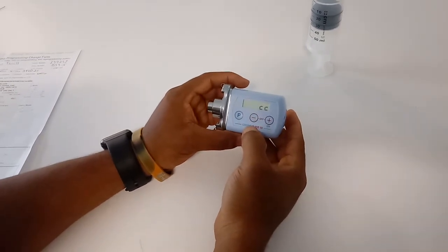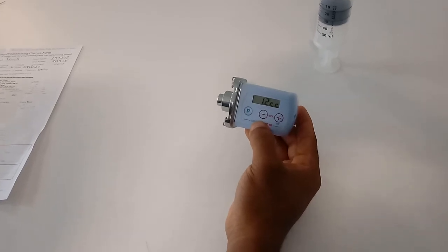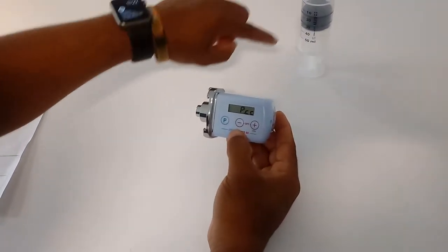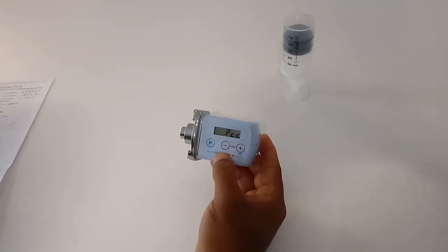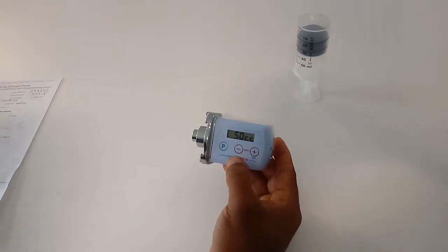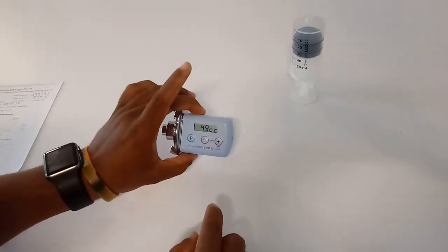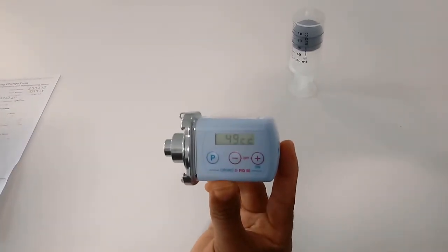I wait. It's going to blink for a while, and then the pump is going to let me know there's a partial volume. Now this P-cc tells me it's a partial volume, meaning I'm not using all 50 cc's, I'm only using a partial. That's what this means. And from this point now, the plunger is not going to extend all the way, to the point where it'll be able to fit 12 cc's only. So this is going to work its way downwards from 50 all the way back to 12. So this might take a little bit of time. So you can watch.